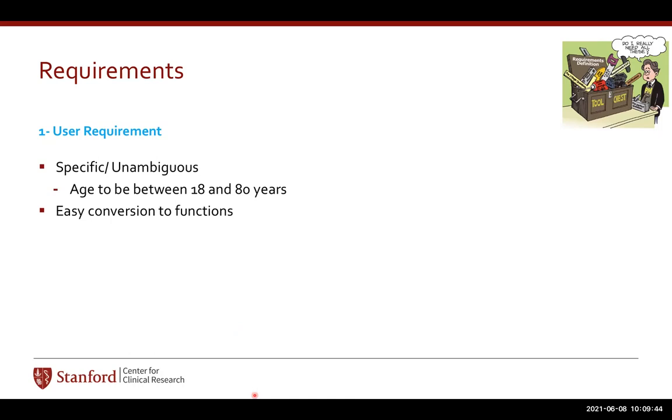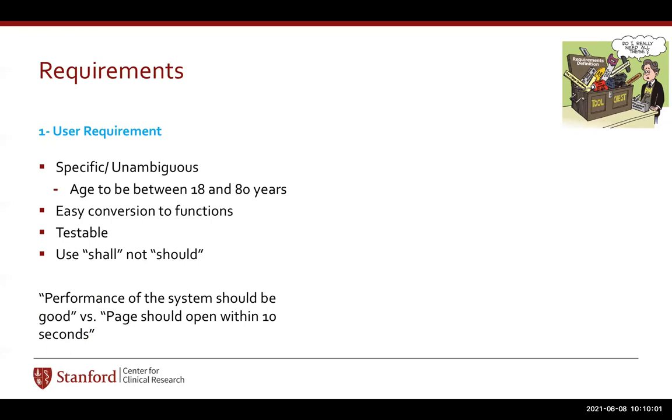One should be able to convert that into a function, and then one should be able to test it. If you cannot test it, then it's no good. For example, you have to use the word shall because it is mandatory, not should. And here is an example. I have seen it in many places. That's why I am citing that.